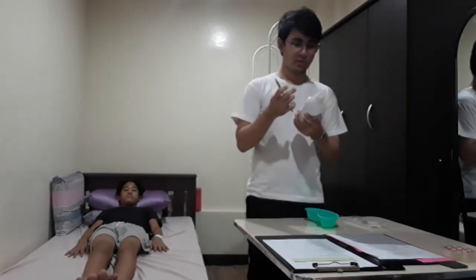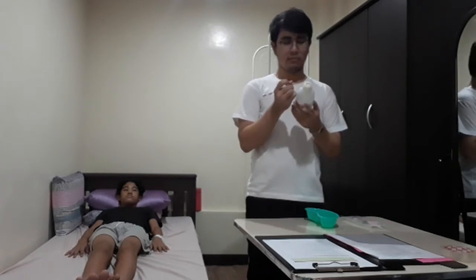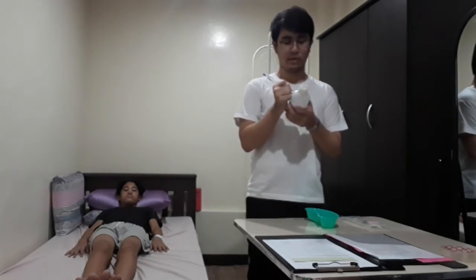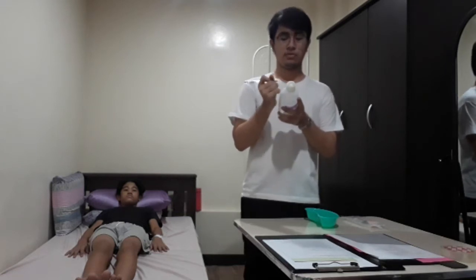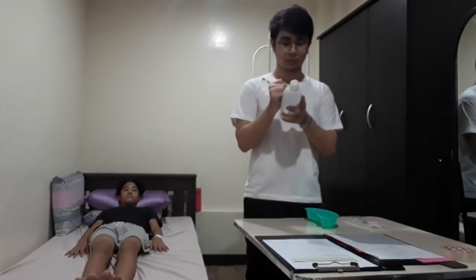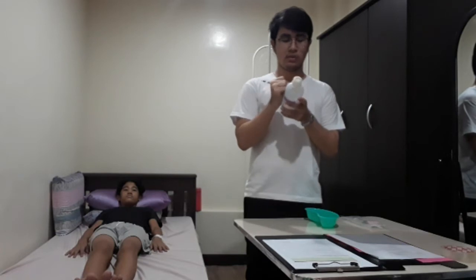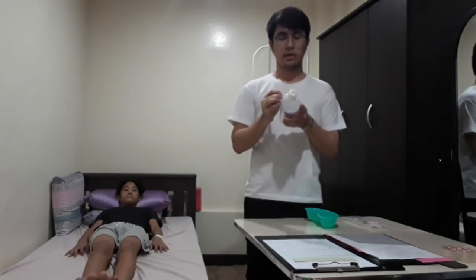So name of patient is Julia Mayumi. And then bed is surgical ward, bed number 1. Then this is her first bottle, so I'll write bottle number 1. Then the IV fluid and rate, I'll write plain normal saline solution 1 liter at 20 drops per minute. Then there's no med infused, so we'll write none or NA.